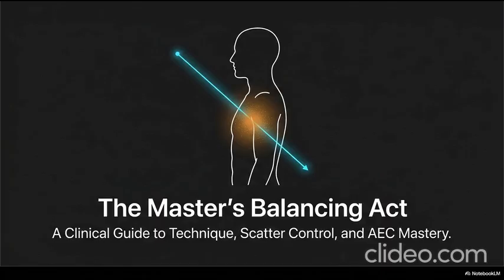But wait, let's take that logic to its extreme. Okay, I see where you're going with this. If mAs is the primary driver of patient dose, and raising kVp allows us to slash that mAs in half, why wouldn't you just crank the kVp up to its absolute maximum power, shoot one incredibly fast, powerful arrow, and essentially drop the patient's radiation dose to near zero? It seems like the perfect loophole, doesn't it? It really does. Just blast one super arrow.